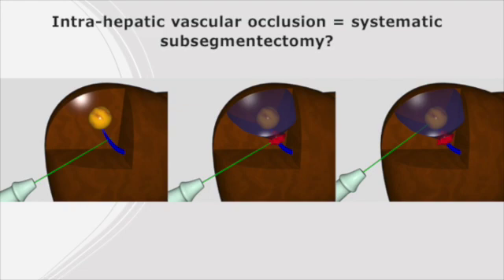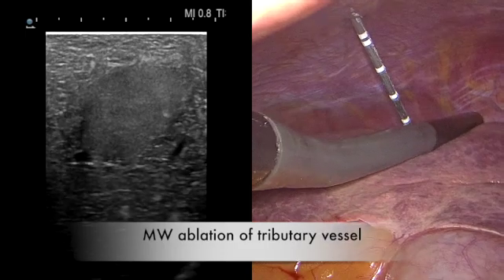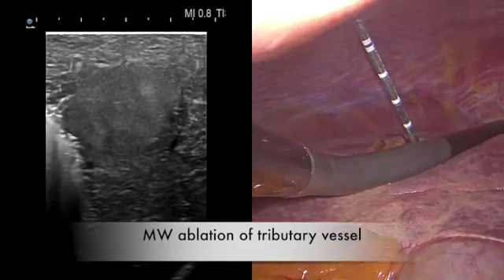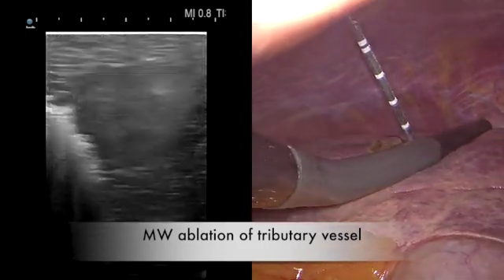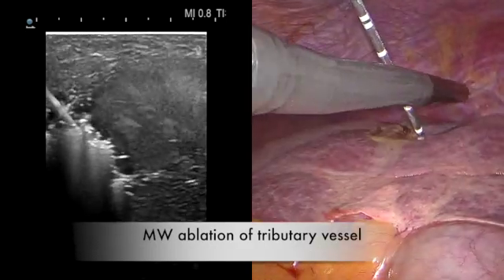On the basis of this principle, we use the microwave antenna to produce a devascularization area centered on the lesion. The microwave antenna is positioned near the tributary vessel of the lesion, and we performed a thermoablation of this area for 3 minutes at 90 watts to induce a selective thrombosis.